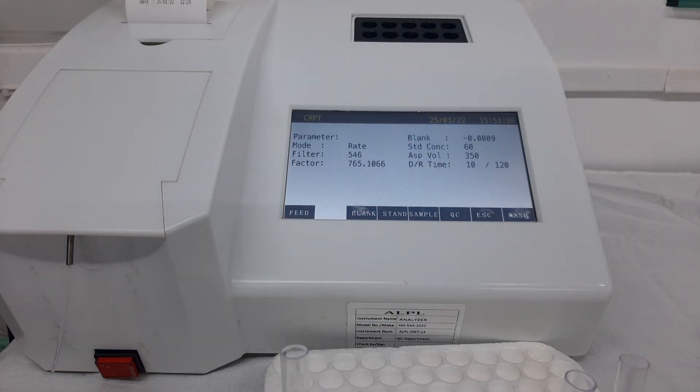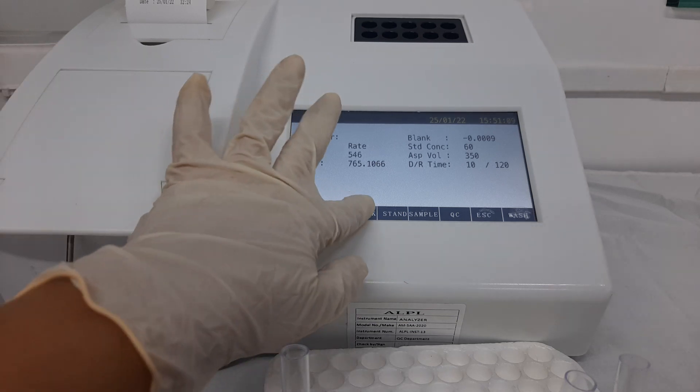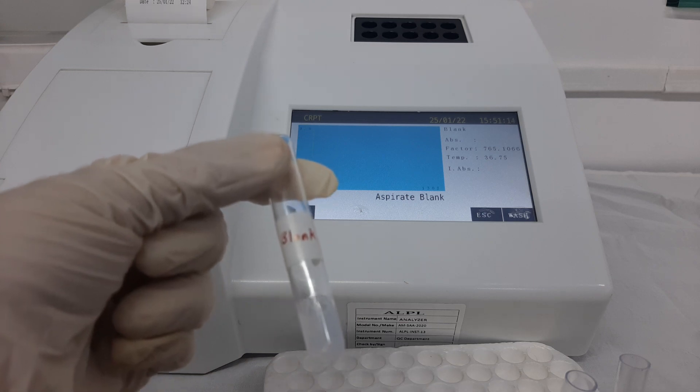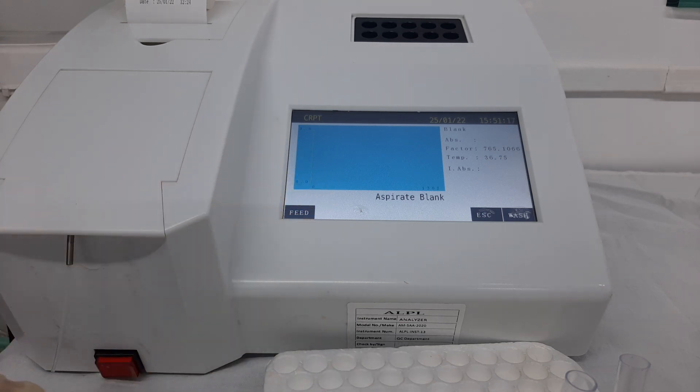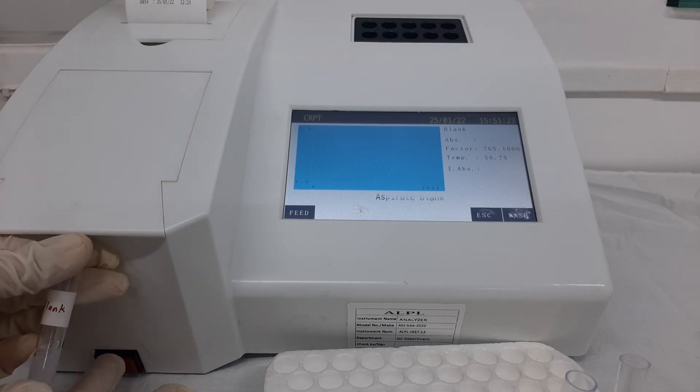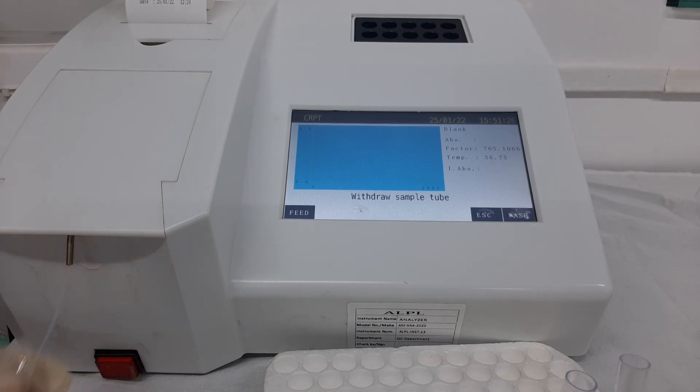To start the procedure, first select the option of blank in the software. As you can see, the program has already asked to aspirate the blank. Take the first tube of blank and aspirate this working solution into the flow cell. A delay time of 10 seconds has been initiated. After the delay time is complete, the program will automatically initiate the read time of 120 seconds.